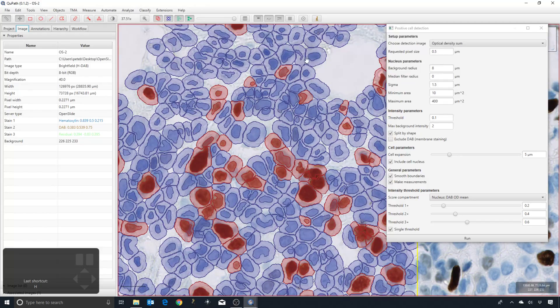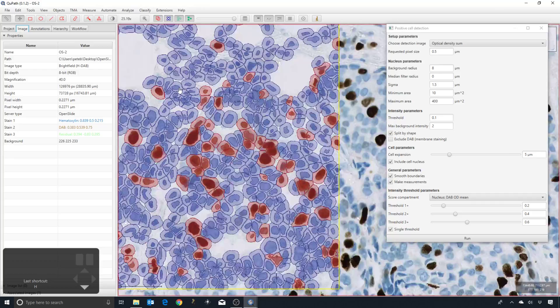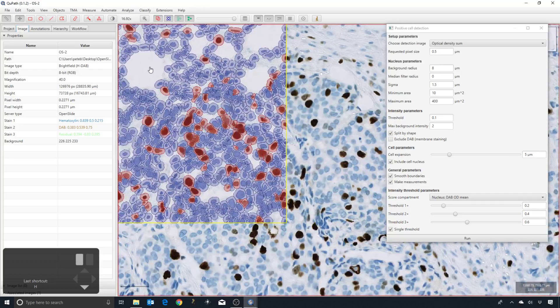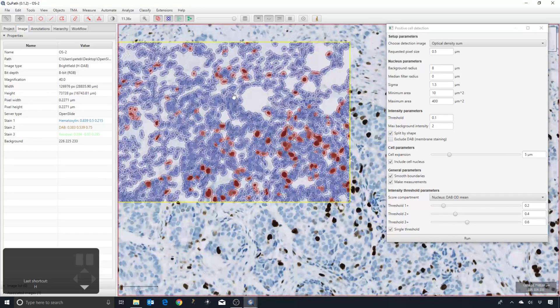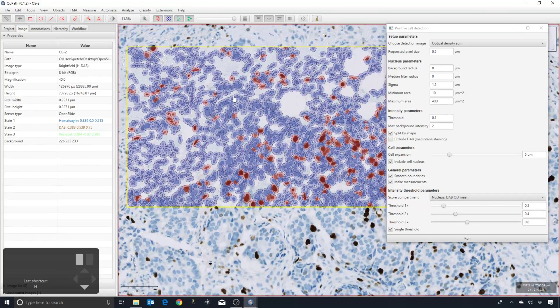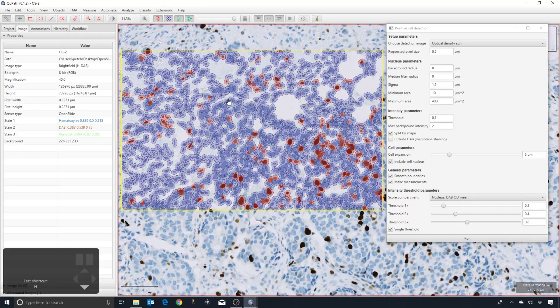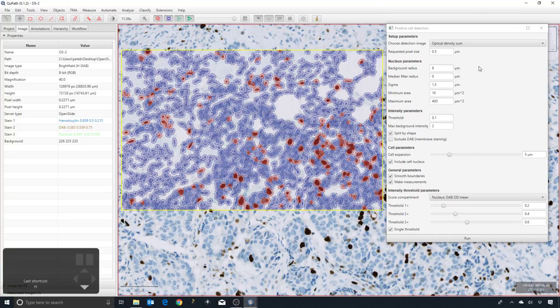Whereas the original image is closer to 0.25, so that means it needs to downsample by a factor of roughly two. That means the image will actually be a quarter of the size of the full resolution image for this region, because you're halving the width and halving the height.